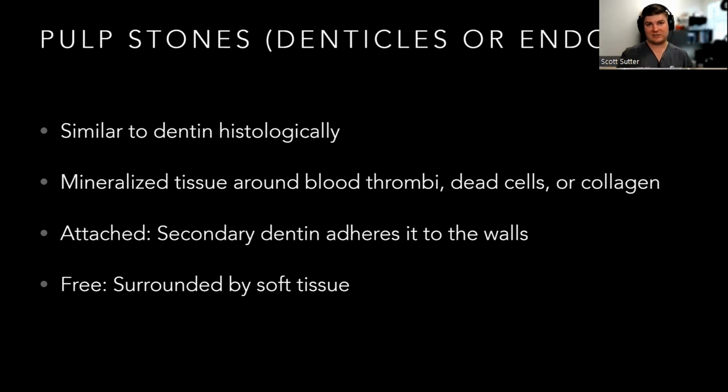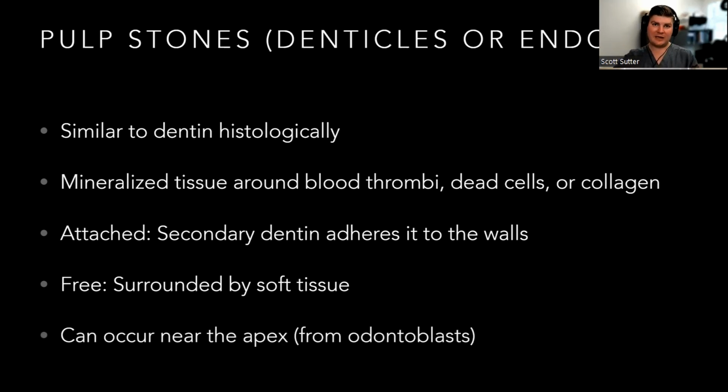So with attached, how do we deal with these? The other thing is they can occur near the apex, which really sucks. These are very, very difficult to get down to. This is where the C+ files help to pop through at the very bottom.